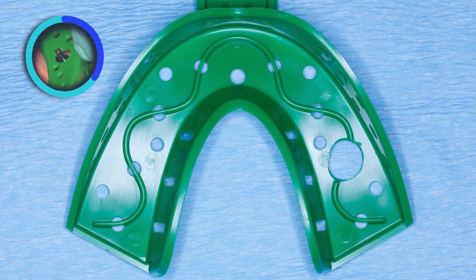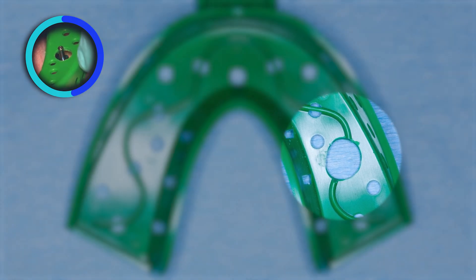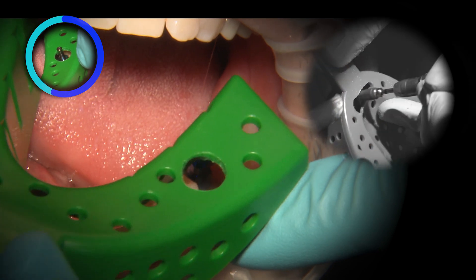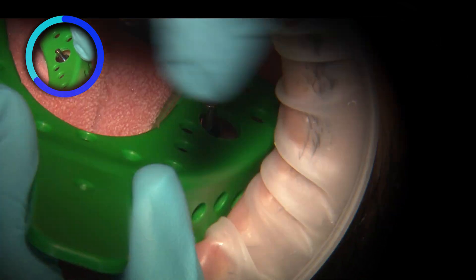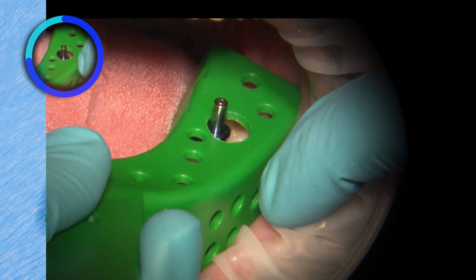In an open tray technique, the tray is first verified for fit and to identify the location of the impression coping. The tray will have to be adjusted to allow the top of the impression coping to pop through. An acrylic burr is utilized to create a perforation in the tray. The tray is tried in again to ensure the impression coping is coming through the center of the hole.